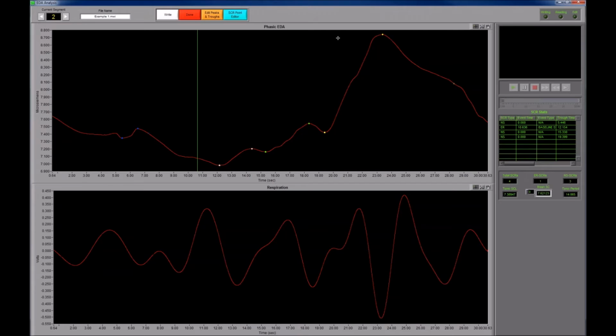So if you were analyzing with your rolling filter right off the bat, you wouldn't have even noticed that this was happening, which is why I definitely encourage you to analyze without filters before you analyze with filters so that you can understand the impact that they're having on your data. But here, that's sort of been taken care of for us.